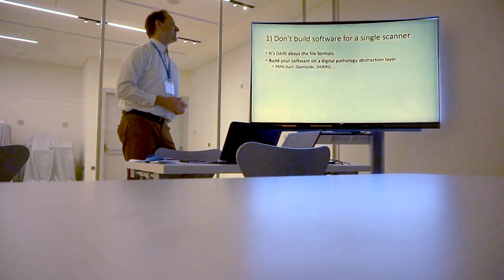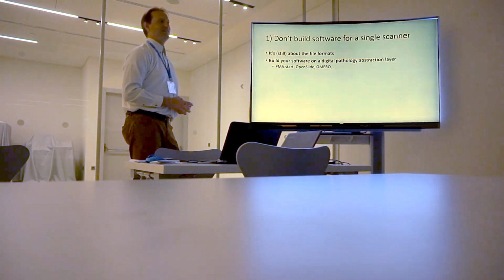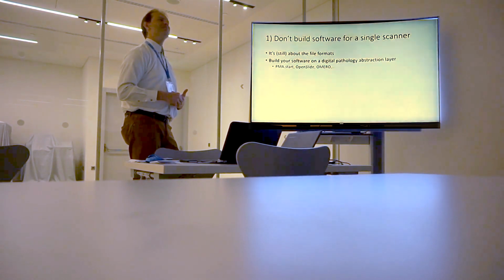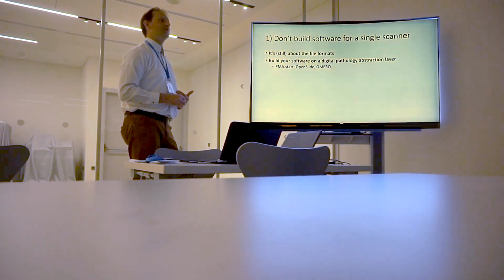And the best way to do that is you build your software on a digital pathology abstraction layer. There's Jeroen's one as well. What's it called? Jeroen's got his own abstraction there as well. I can't remember what it's called. Lots of people using it. I want to put it in. I don't know, use OpenSlide.